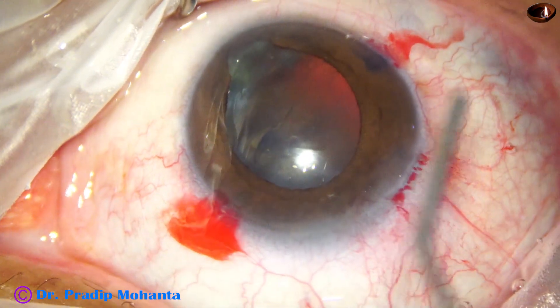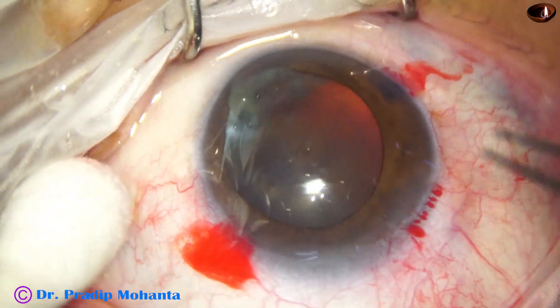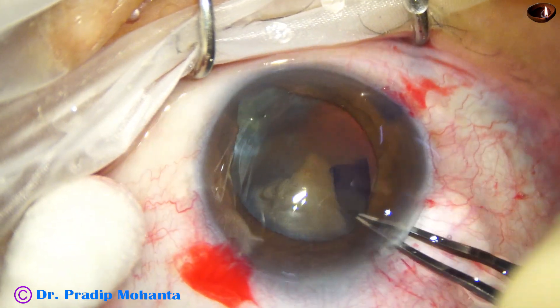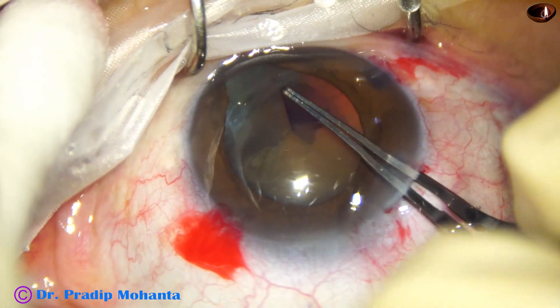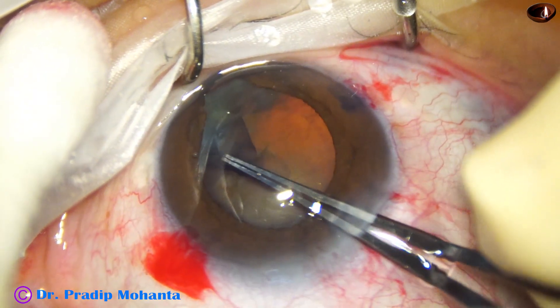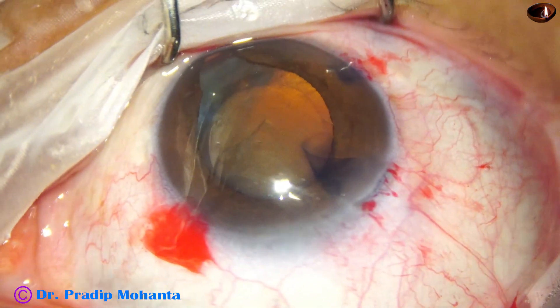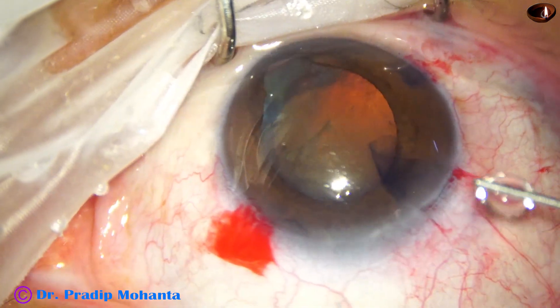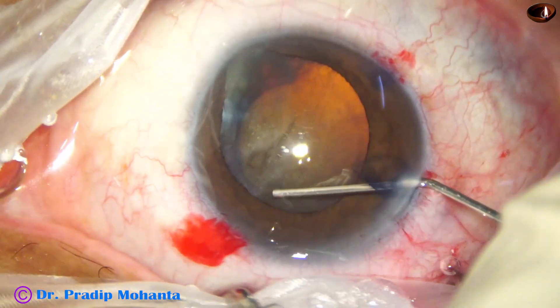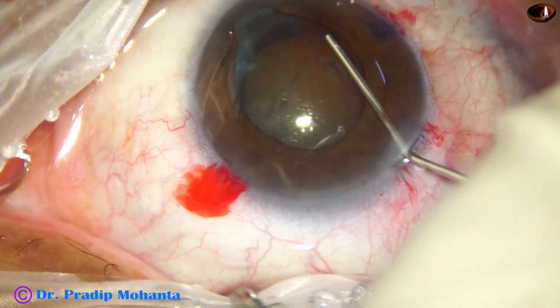I find that the pupil has become small, so I inject some visco, and because of the visco, the pupil dilates a little bit. Now I am doing capsulorrhexis. Capsulorrhexis should be made in such a way that we don't go down into the colobomatous area. The size of this capsulorrhexis is about 5 mm. Though the cataract is hard, I didn't do a large rhexis in this case — I have to manage with this 5 mm rhexis.